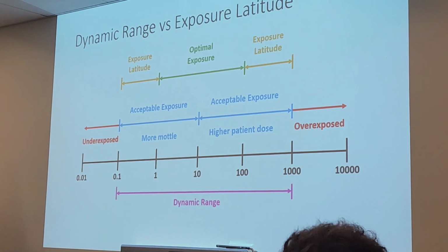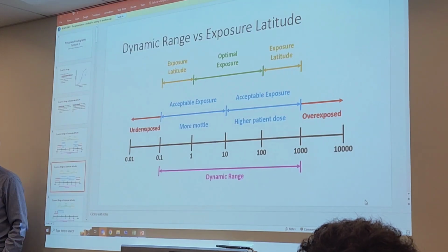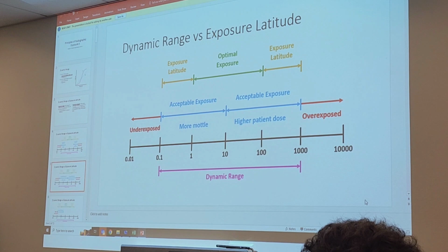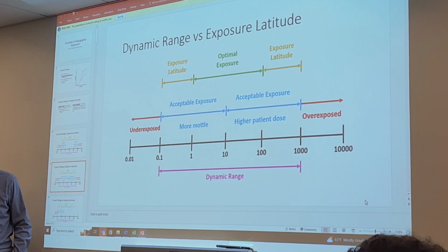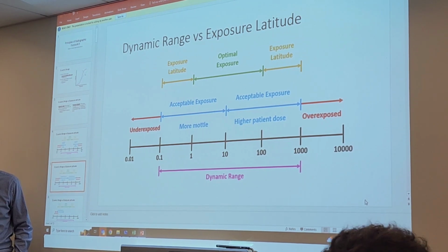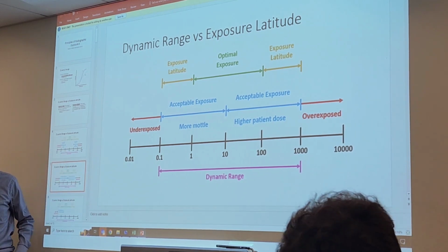That would be more like the 4th page that you have. I don't want to say that it's exactly for thinner anatomy because there are other things going on there. But you can think of page 5 as thinner anatomy, page 4 as thicker anatomy. We shouldn't expect to see graphs like these on the exam. I'm not going to ask you about graphs like this. These are just to illustrate the concept of exposure latitude versus dynamic range.